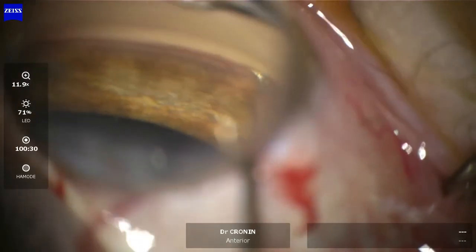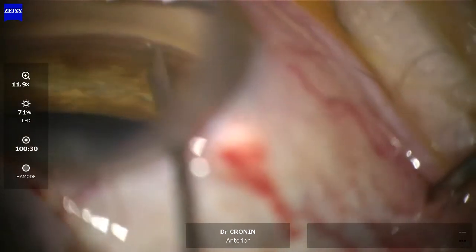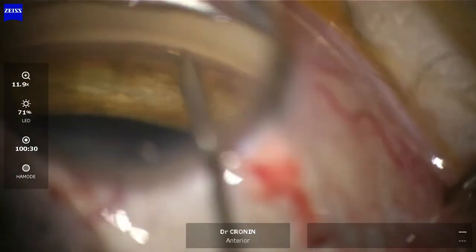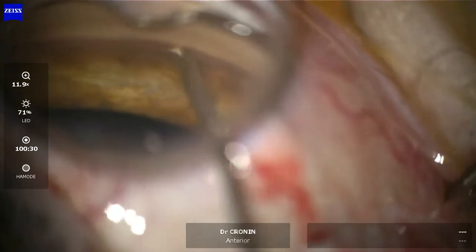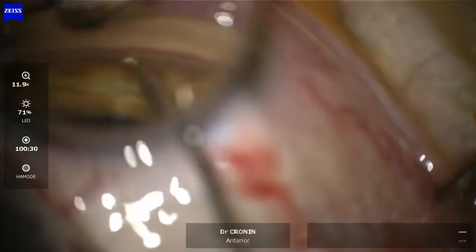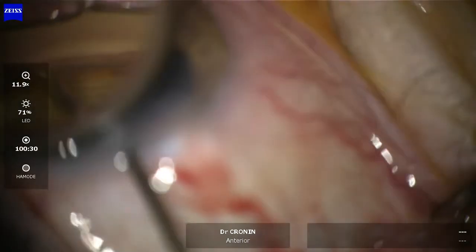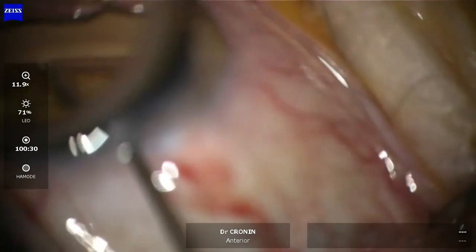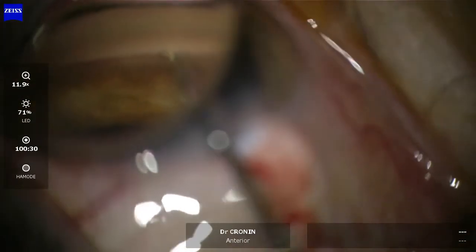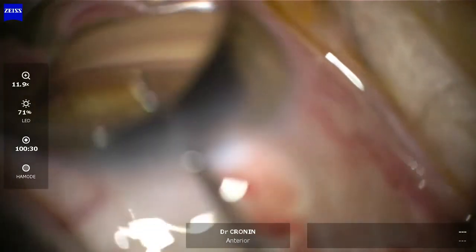I've filled the eye with a combination dispersive and cohesive viscoelastic here. I've used Amvisc Plus. Healon would be another possibility. You can see I'm incising into the trabecular meshwork, into the canal of Schlemm. After this, sometimes you'll see a little flap of residual tissue and you may need to remove that with intraocular forceps.